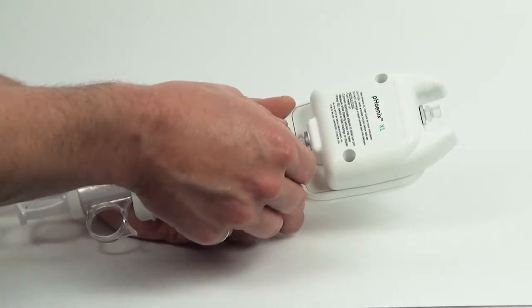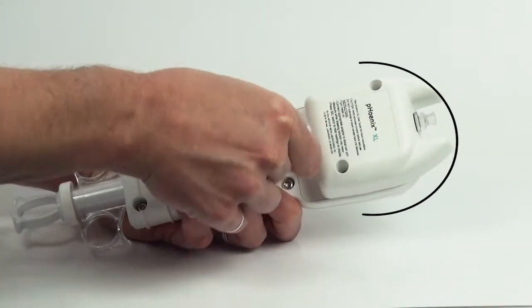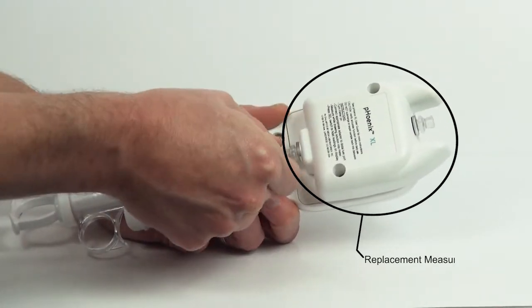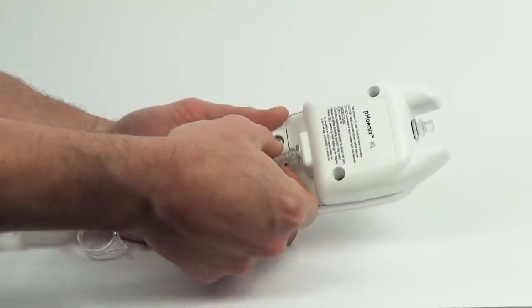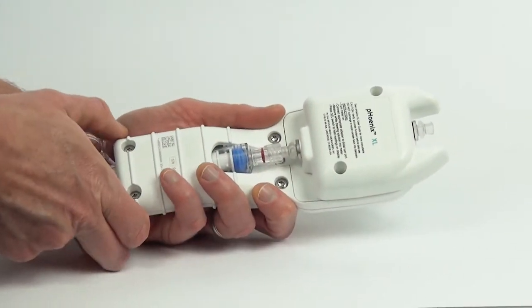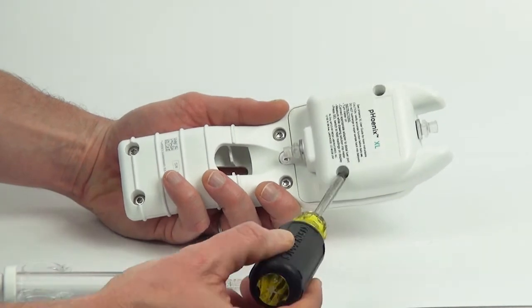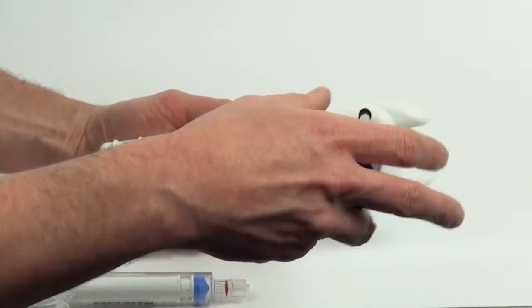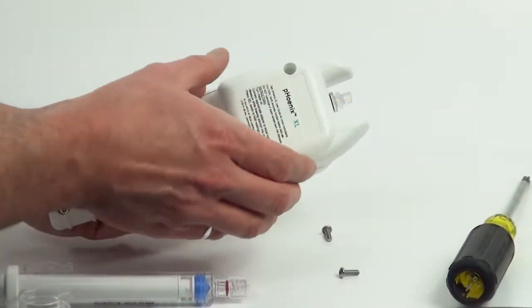The Phoenix XL replacement measurement module eliminates the need to send in your meter for service. Instead of sending your meter in every year for calibration, Mesa has engineered the Phoenix XL to offer a replacement measurement module that can be easily replaced in the field. Simply order a new calibrated replacement module, replace, and you're all set.